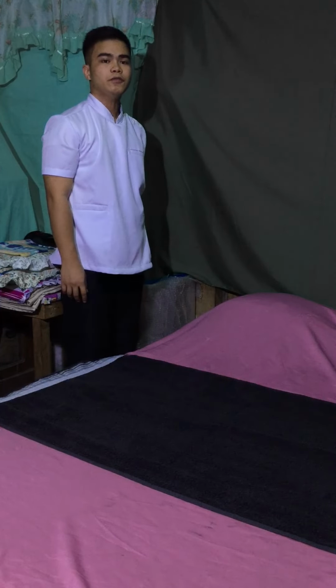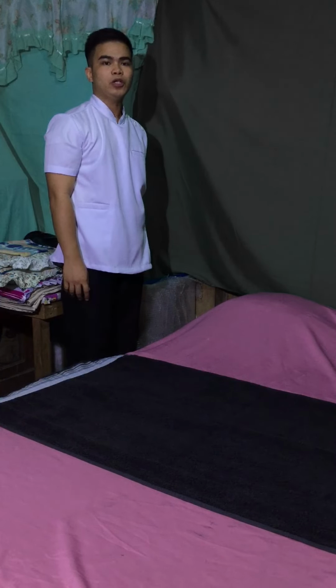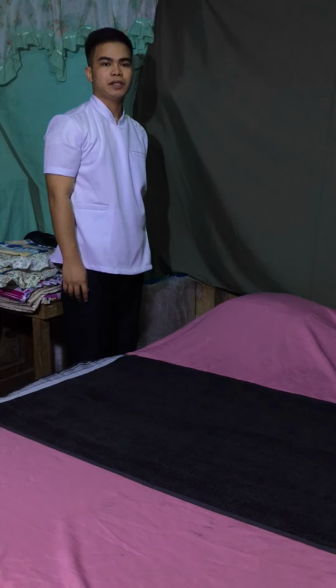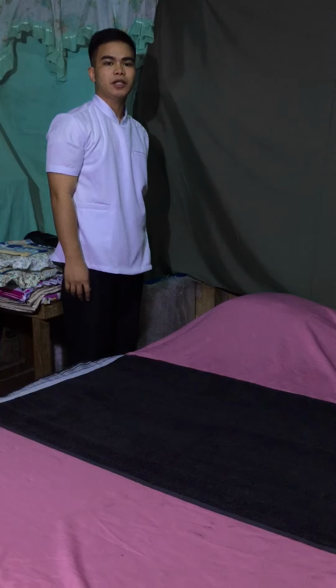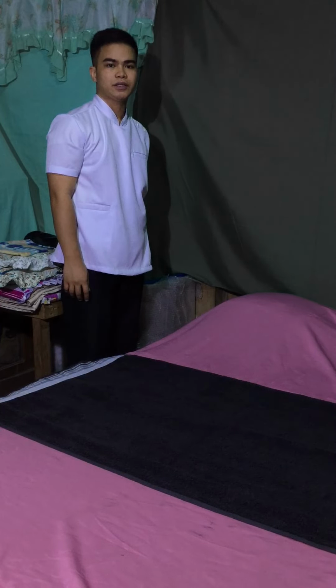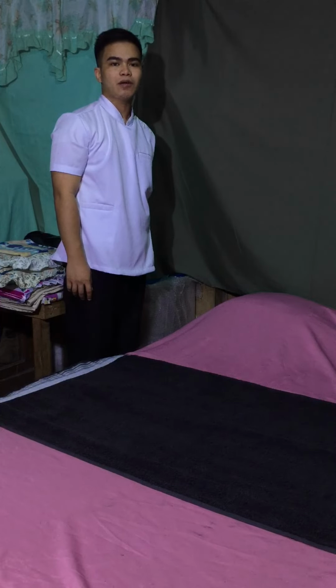Then, move to the other side and tuck in the bottom sheet under the head of the mattress. Pull the sheet firmly and miter the corner of the sheet. Pull the remainder of the sheet firmly so that there are no wrinkles. This secures the sheet to the bed. Wrinkles can cause discomfort for the patient and breakdown of skin.